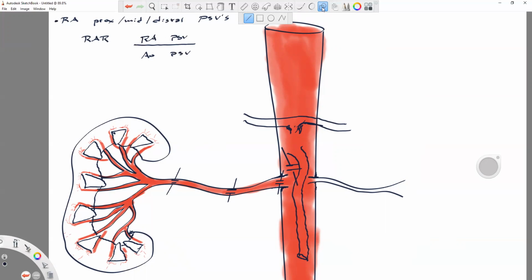However, having said that, just like everything else in ultrasound, if the stenosis is here, then that's the important part. That's the part you find in this area here. That is the part where you find the highest velocity. And if it's closest to distal, then we call it distal. If it's closer to mid, we call it mid or whatever. But chances are, most of the time, plaque builds at the beginning of arteries. So chances are pretty good that you'll find it here at the proximal aorta.